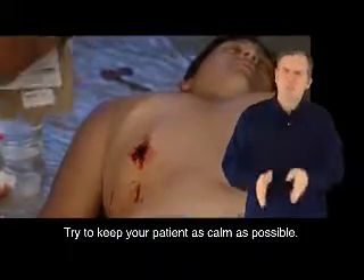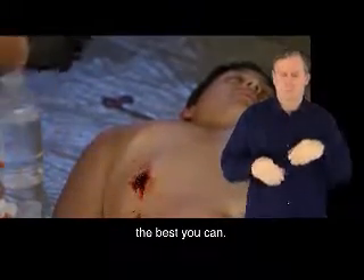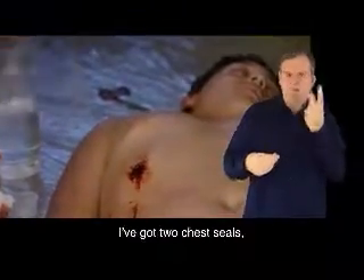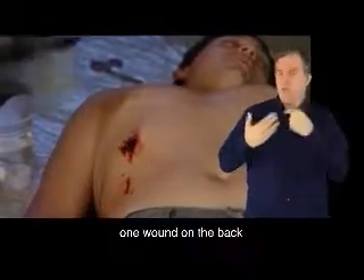Try to keep your patient as calm as possible. Try to get them to slow their breathing down the best you can. When I open this up, I've got two chest seals, so I could actually do a through-and-through — one wound on the back, one on the chest, if I had that.